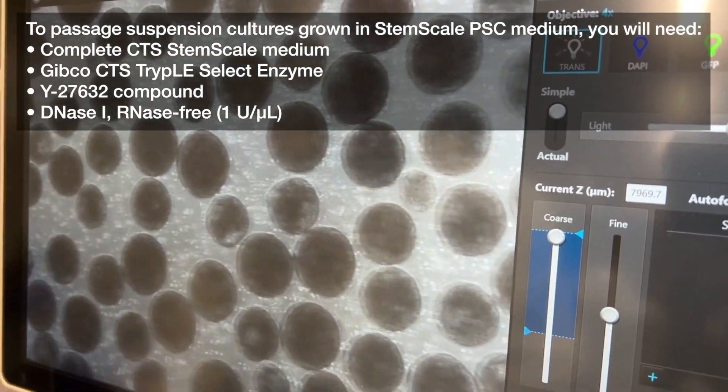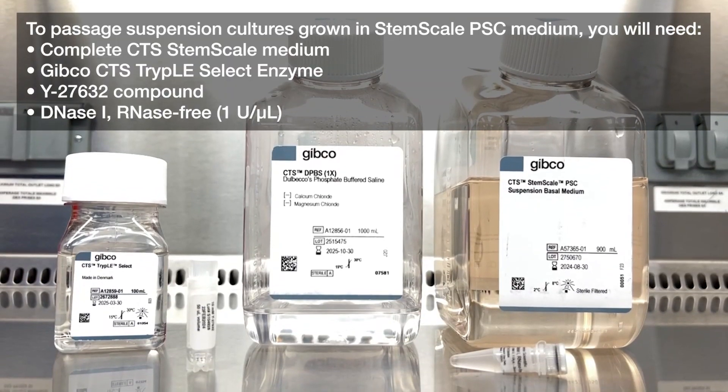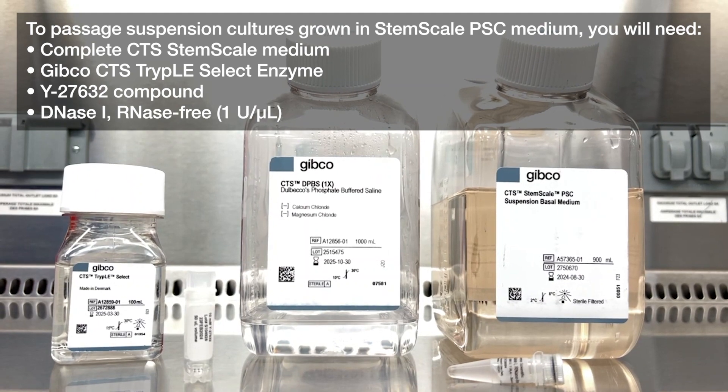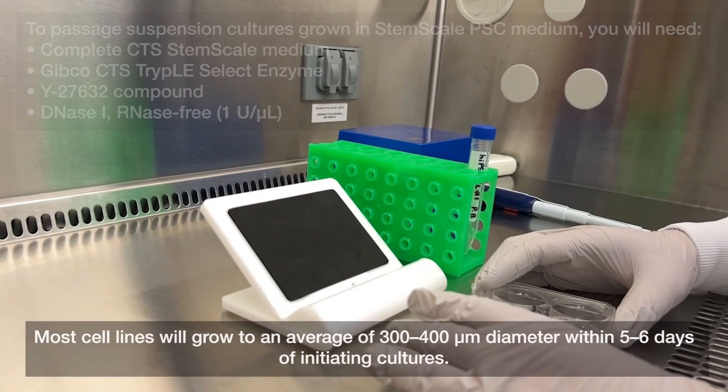To passage suspension cultures grown in StemScale PSC medium, you will need: complete CTS StemScale medium, Gibco CTS TrypLE Select enzyme, Y27632 compound, and DNase 1.